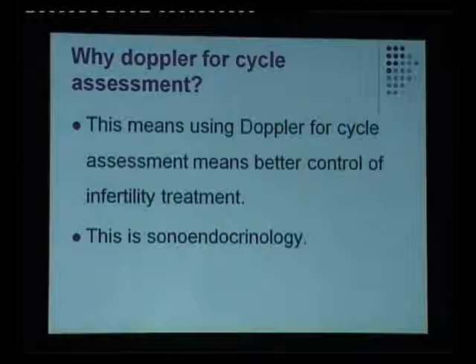Increase in the perifollicular vascularity of the dominant follicle in the theca layer starts developing as early as the 8th day of the cycle, and the fall in the perifollicular RI starts 2 days before ovulation, reaches the lowest at ovulation, remains low for 4 days, and then gradually rises, reaching 0.5 in the mid-luteal phase. This decreasing resistance can be related to the rise in estrogen levels.